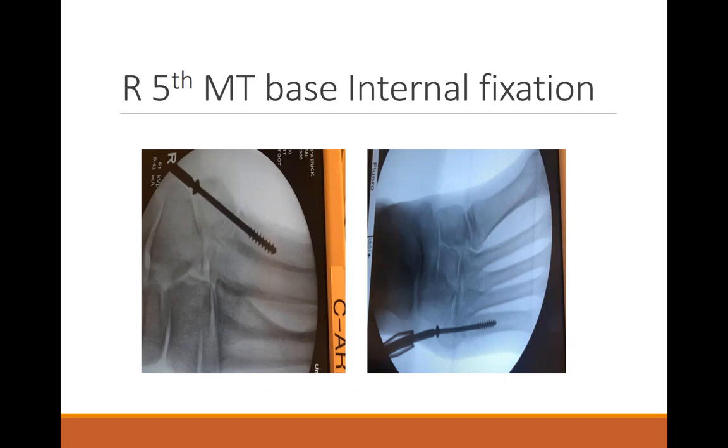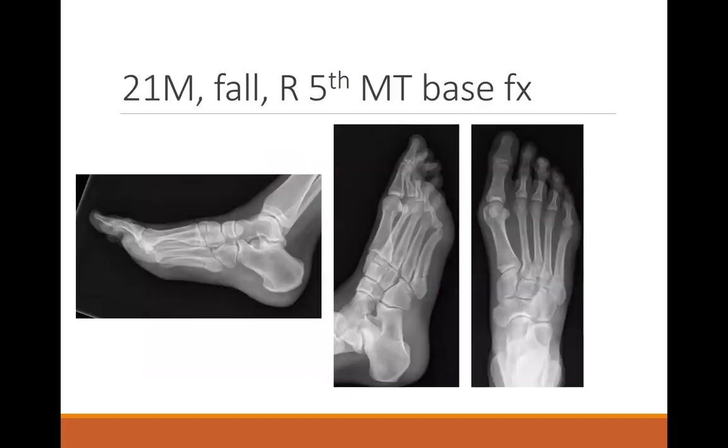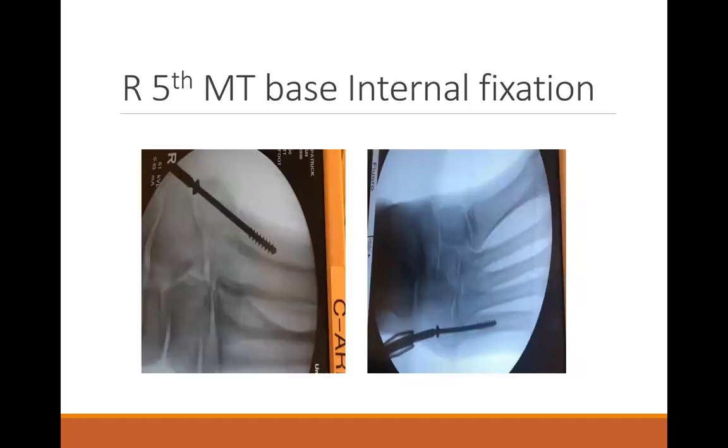So Dr. Kirschenbaum was talking earlier about sclerosis at a fracture site. Is there any here? There's none there, no. What size screw is that? It's a 4.0 screw, not cannulated. He's a big guy. There have been studies showing as high as a 6.5 screw. I think that's pretty big, but.